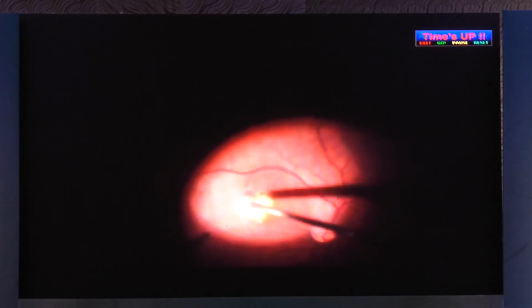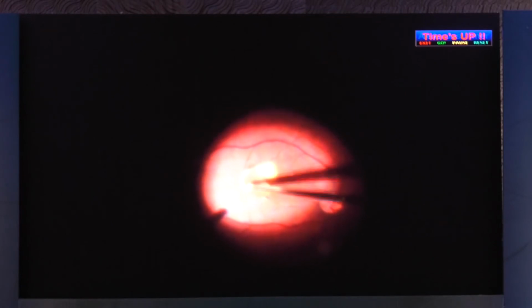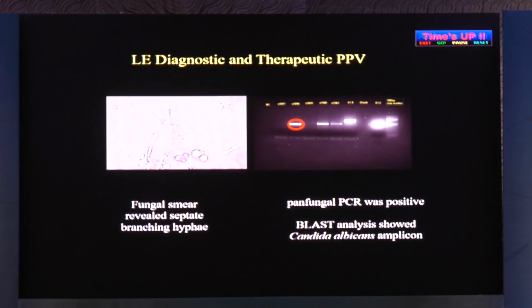We are aspirating these exudates on the retinal surface. You can see the hyaloid being cut here. So it was these exudates that actually demonstrated that there was a fungal infection. So all the tests corresponding to fungus were positive.